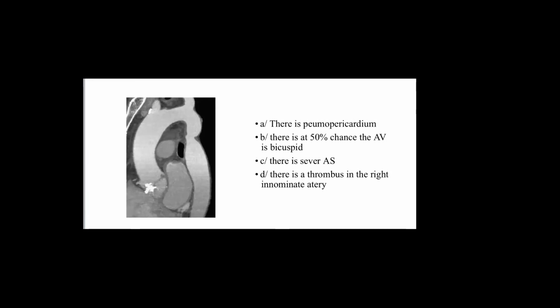Now, what is this? There is a pneumopericardium, which is here. We think this is pneumopericardium, this here. Is it a pneumopericardium? What is this structure? Trachea. This is the trachea. Okay? Yeah, exactly. So, no pneumopericardium.